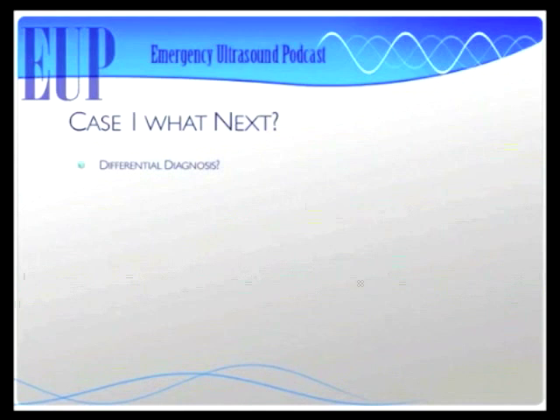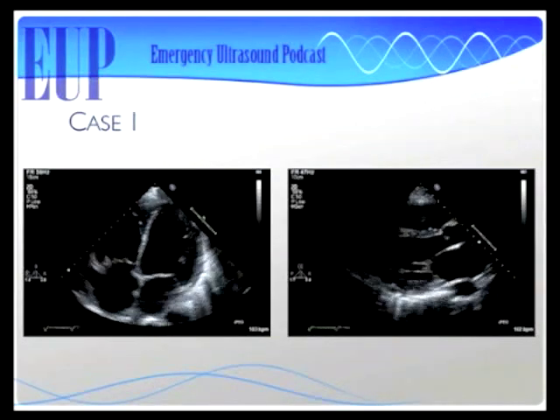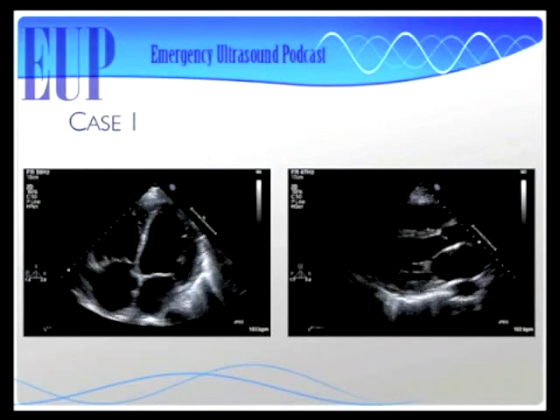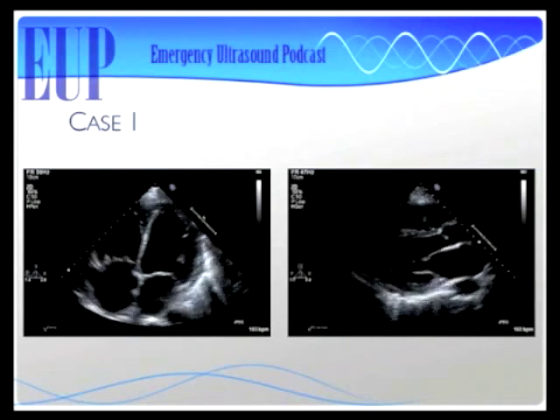What if instead of doing all that, you ultrasounded him a little bit? Okay, whatever. So here's his heart. So now you're looking at an apical 4-chamber view, which is on the left, and a parasternal long axis, which is on the right. What do you think about that heart? I'm no echocardiographer, but it seems like it's not quite squeezing as much as it should.